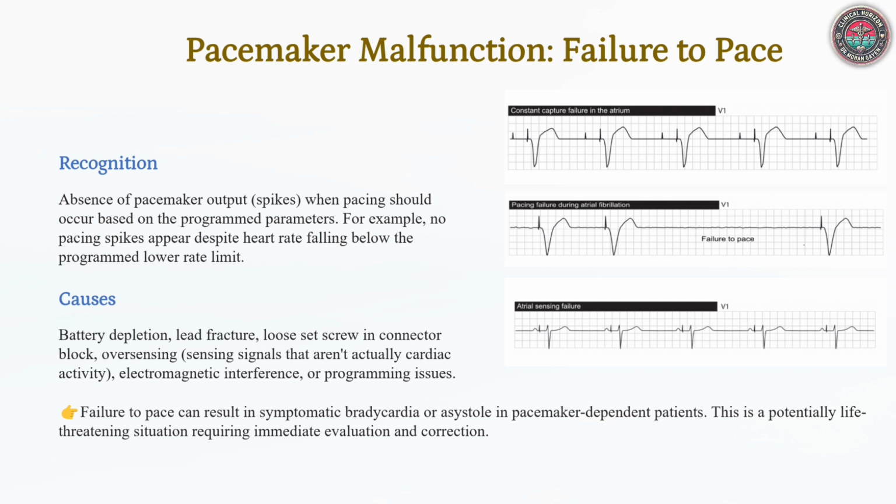Common causes include battery depletion, lead fractures, or oversensing of external signals, such as skeletal muscle activity or myopotentials. Prompt troubleshooting and device interrogation are required to prevent life-threatening consequences.